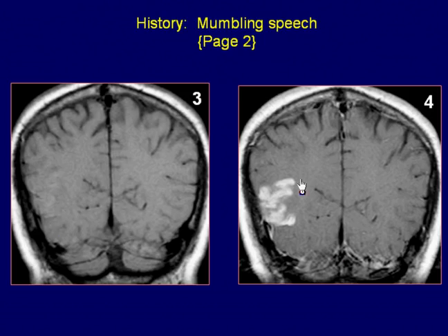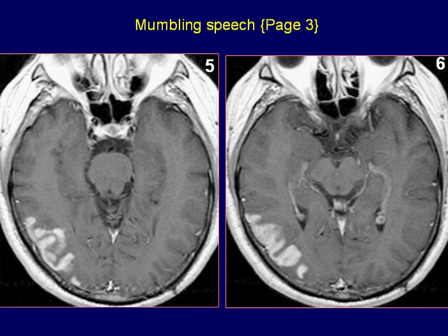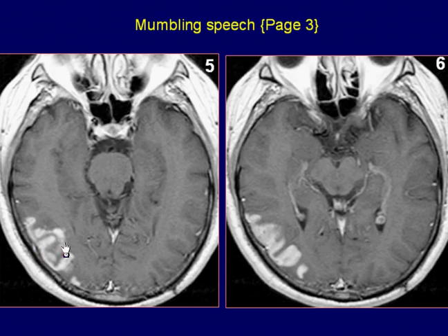Coronal post-GAD T1-weighted image demonstrates intense gyriform enhancement of the lesion. Axial post-GAD T1-weighted images also demonstrate intense gyriform enhancement.